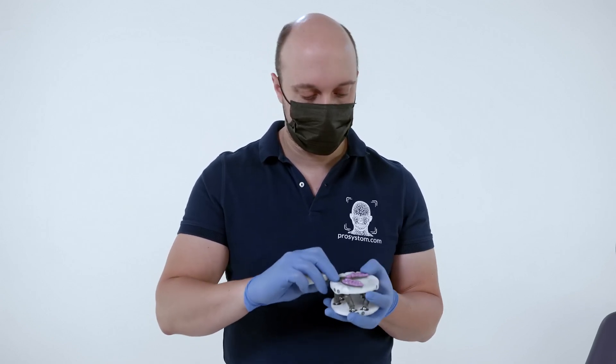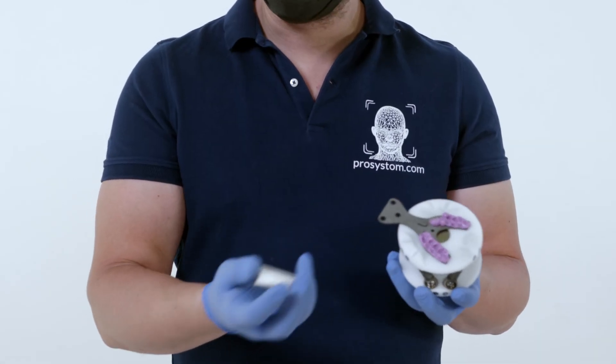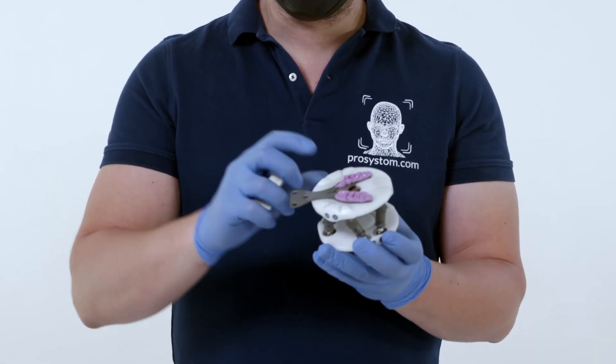We fix the bite fork on the upper base of the rack. A plaster model is located on the fork according to the registry.